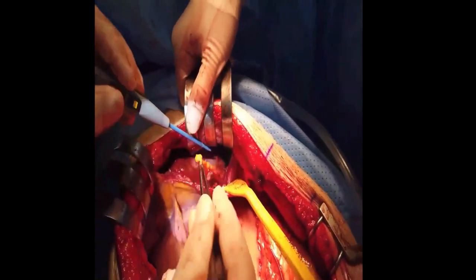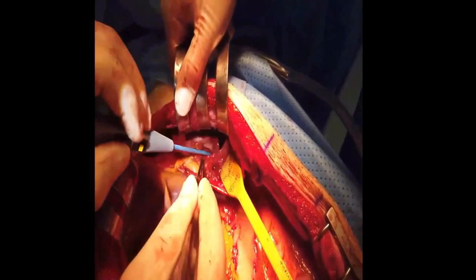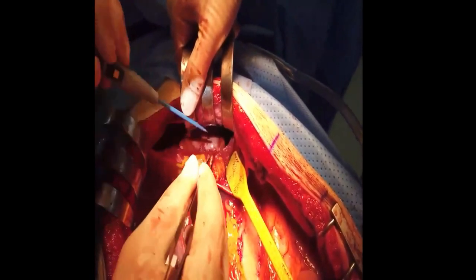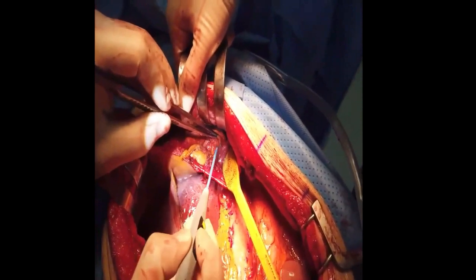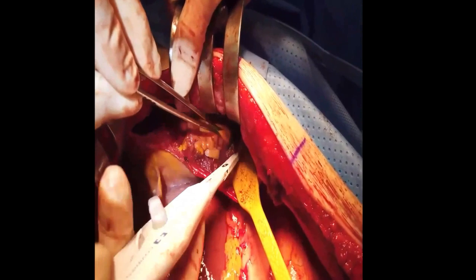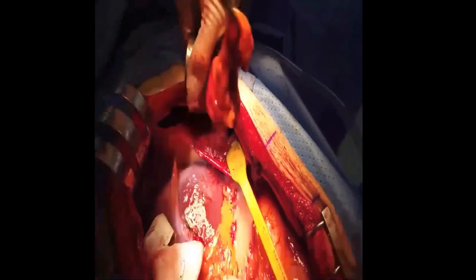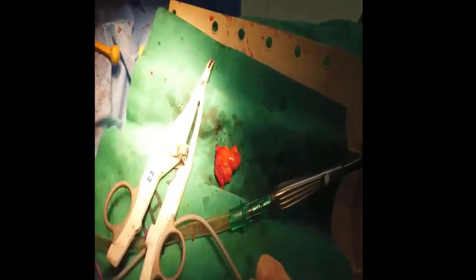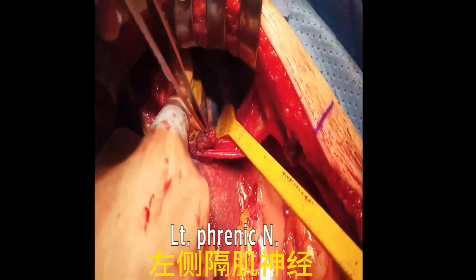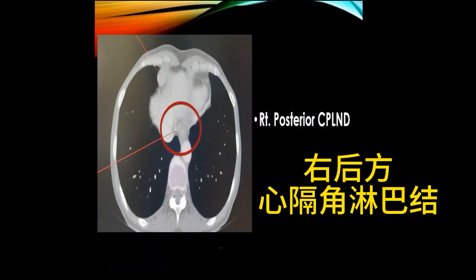It is important to have a good view by gentle retraction. Left anterior pericardial fat tissues containing left anterior cardiophrenic lymph nodes were dissected together using an electrocautery and energy device. You can see the left phrenic nerve. We need a different approach for posterior cardiophrenic lymph node dissection.